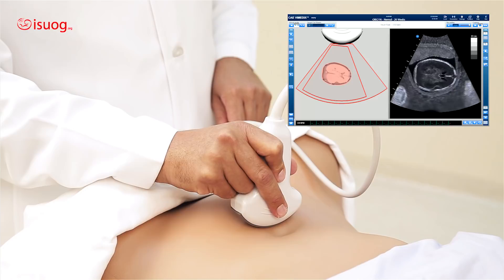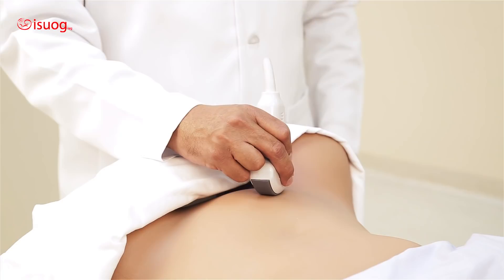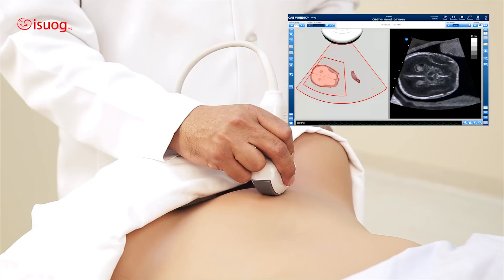Now I am going to show you another combination of movements — to get the fetal face. As you can see, you are at the trans-thalamic plane. You need, from your position now, to rotate 90 degrees. So now I am rotating 90 degrees to get a different plane.